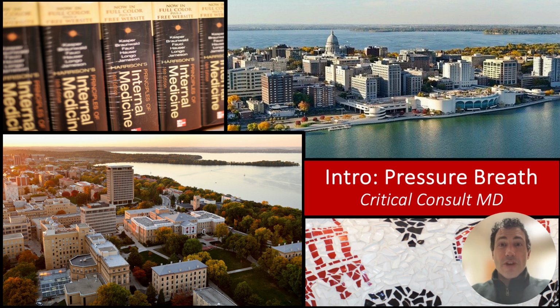That's it. That's introduction to pressure breaths, and they're used in a bunch of ventilator modes. All the smart pressure control modes like PRVC, PCV-VG, of course pressure control modes, bilevel and APRV modes use the same physiology, and pressure support modes are the same with one tiny adjustment to this. We'll talk about that another day.